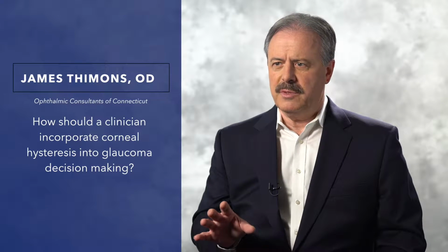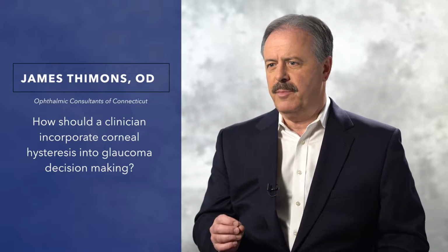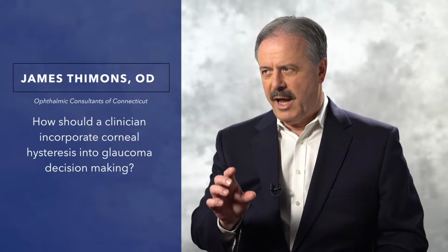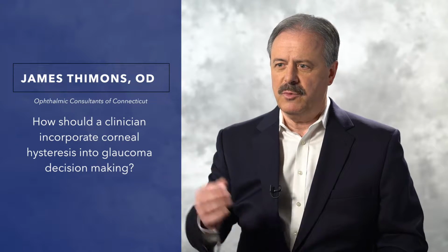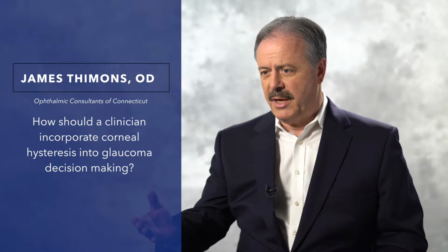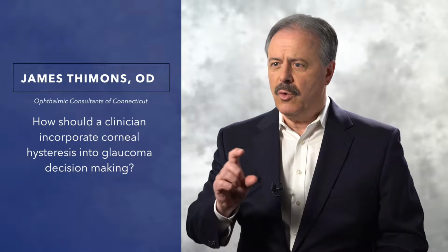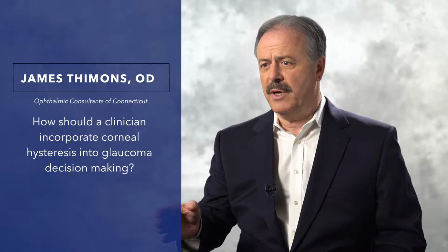Corneal hysteresis is a key element in the decision-making process. There are hundreds of papers that identify hysteresis as the mechanism or component that allows me to predict future behavior, both in degradation of visual field, loss of retinal nerve fiber layer, correlation to glaucoma, pressure levels relative to progression.